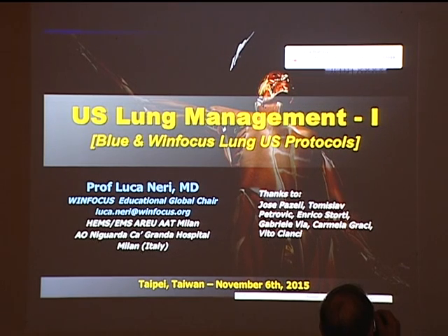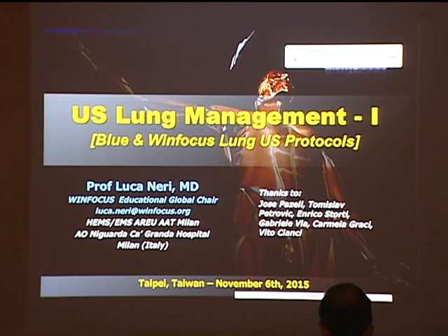Already Dr. Cheng has introduced some concepts, particularly about the ventilation signs, like the lung sliding, proving the movement of the visceral pleura on the parietal pleura. So proving the movement of the lung. Movement of the lung doesn't necessarily mean ventilation of the lung, but most of the time it does.